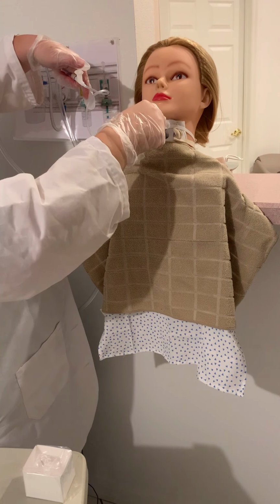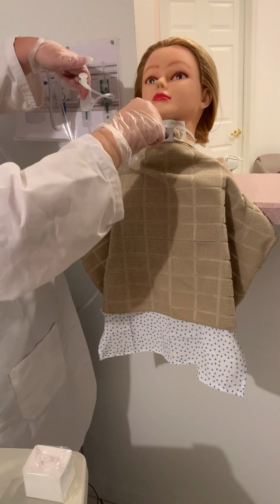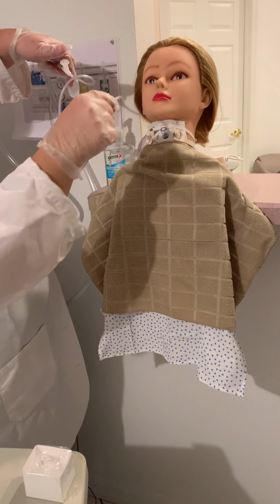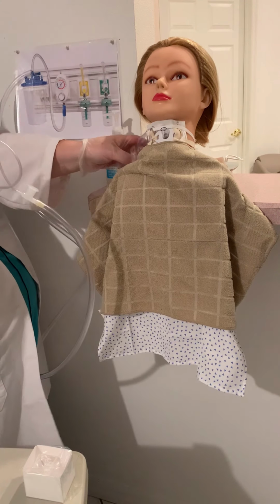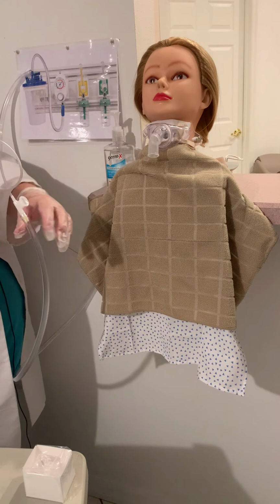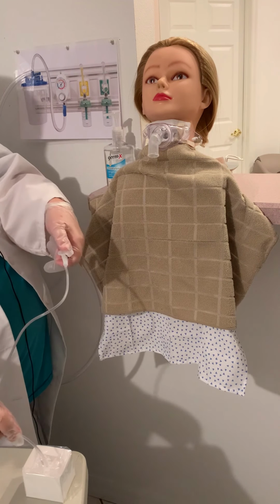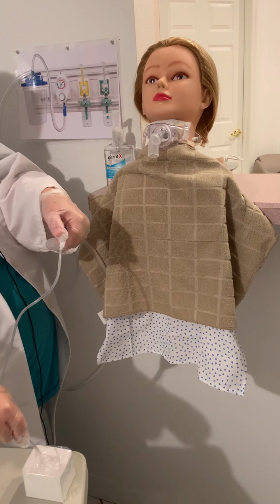Make sure we're not touching the trach with our thumb. We're going to go on and off here while we rotate and come out. Okay, we'll hold this. We'll put that oxygen back on. Okay, and then we're going to do continuous, keep our thumb on the suction to clear this through the line.